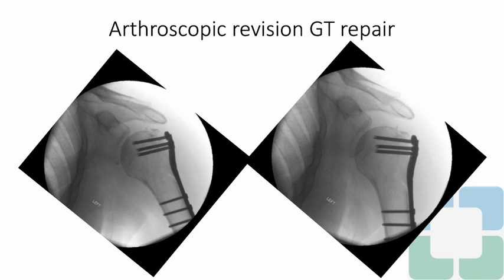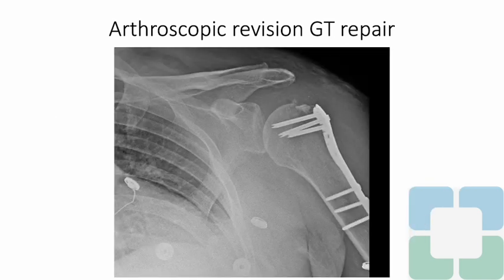Intraoperative fluoroscopy was performed, shown here, which demonstrates reduction of the main fragment back down towards the plate. Additionally, x-rays taken in the postoperative unit demonstrate adequate reduction of the main fragment of the greater tuberosity.